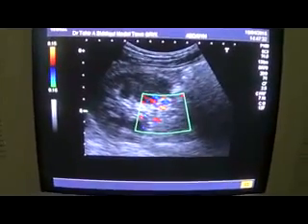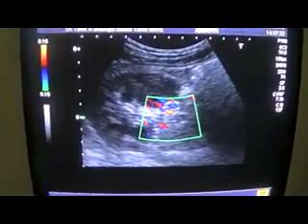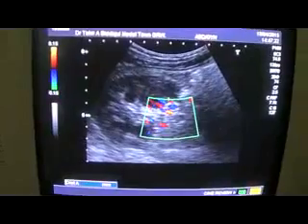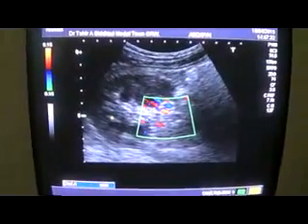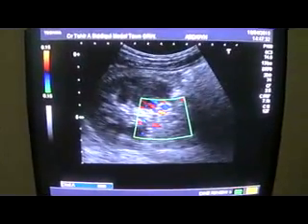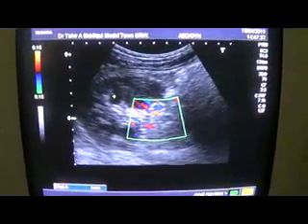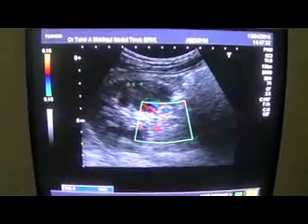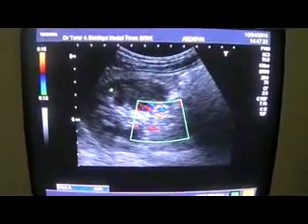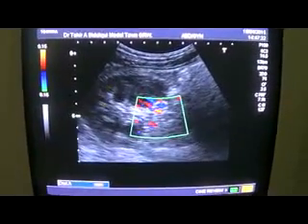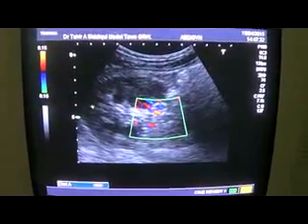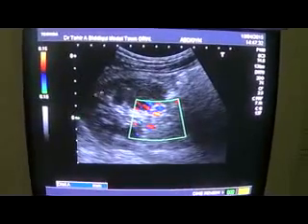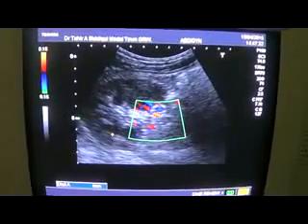In view is the right kidney, shown in transverse section. This is the right kidney showing normal pyramids, cortexes, echogenicity is normal, central sinus echocomplex is normal, and the parenchyma is okay.